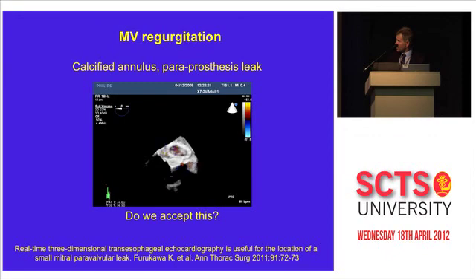And again, the beauty is you can manipulate it and see that it's on the anterolateral part, and you can exactly point out where it is. Now we can decide, are we going back and put extra sutures? He said, no, I cannot do that. I've already tried, and it is basically like putting it into rock. So you just accept it.